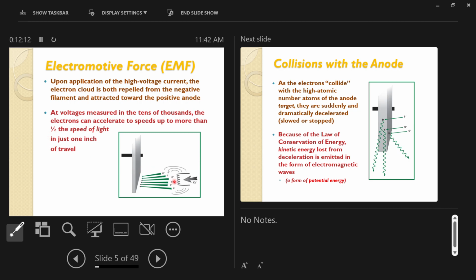The space between cathode and anode face is about 1 inch. So these electrons jump about a 1 inch gap in a tiny fraction of a second. Okay. Remember from a few lectures ago where we said in a circuit electrons only move about 1 inch in an hour, right? Well, in this split second they're going to move a full inch. That's because they're not moving through a wire over this split second. They're actually jumping a gap in space from the filament wire cloud to the face of that spinning disk. They're arcing from one side to the next.